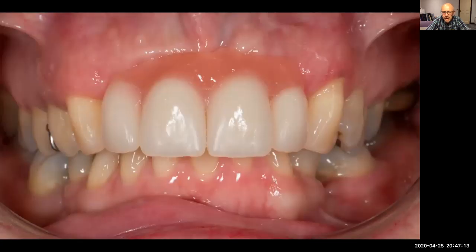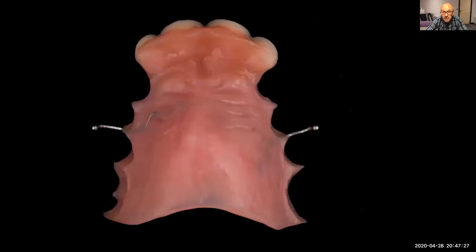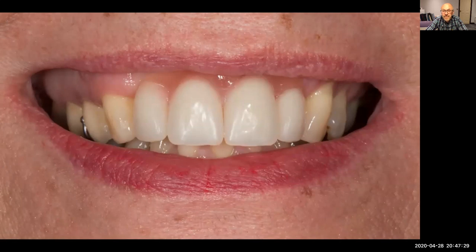Here we go. So this is back to Wendy now with the UV gel. It looks a little bit scruffy there, but it just disguises where we've got the resorption and just looks miles better actually when she left. Because we've got a really gummy smile, a really high smile.